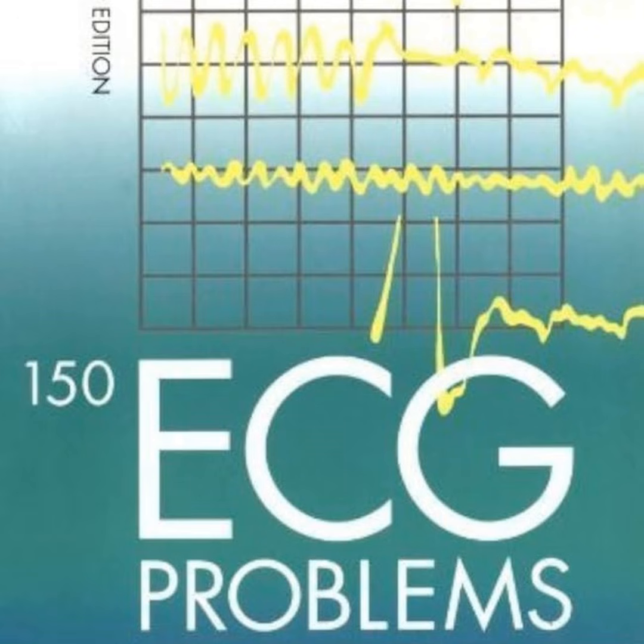Which brings us perfectly to the great mimic. You are evaluating a 35-year-old man who complains of exertional chest pain and occasional exertional syncope. Okay. You pull the ECG and see massive, gross, symmetrical T-wave inversions across the anterolateral leads, so I, aVL, and V4 through V6. Now, those massive inversions usually scream one thing: a massive acute non-ST elevation myocardial infarction.